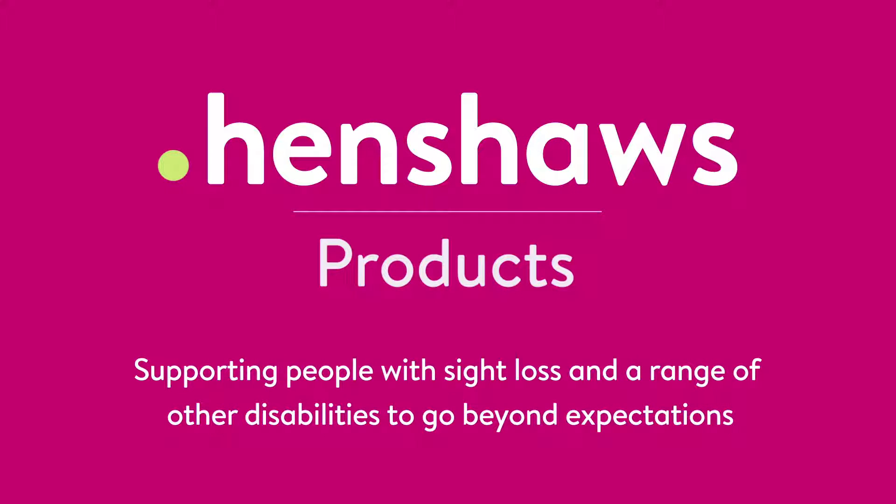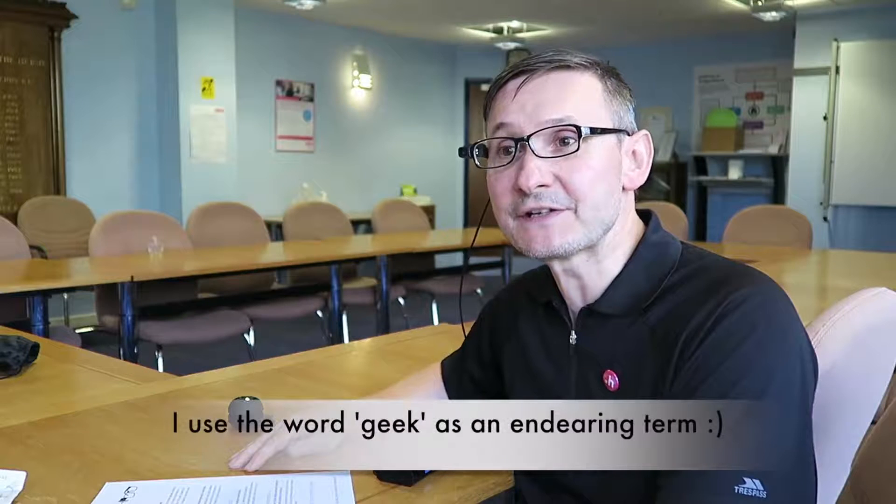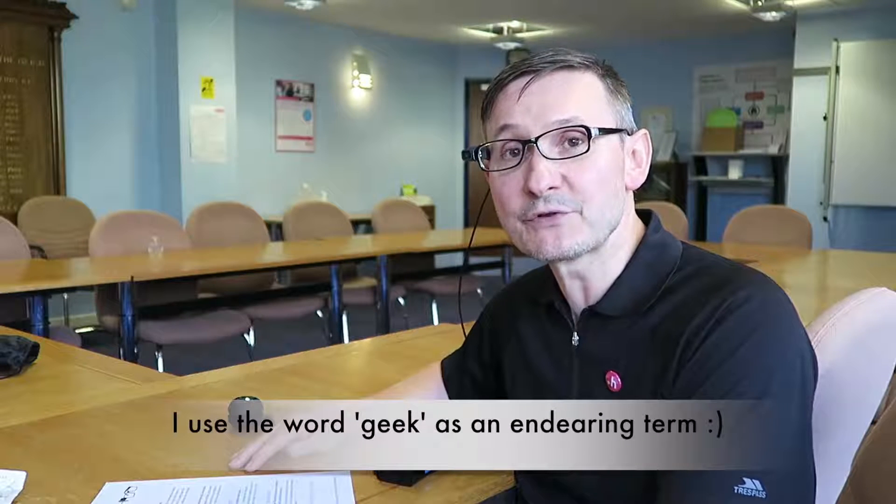Henshaws products support people with sight loss and a range of other disabilities to go beyond expectations. Welcome to Henshaws Tips, Tricks and Tech. As promised, I'm going to do another video on the RCAM. This video is just about version 7 — some of the things they've done inside the unit that make it even better. The geeks and gurus at RCAM have brought some new features, so I'm just going to show you them and talk around them.